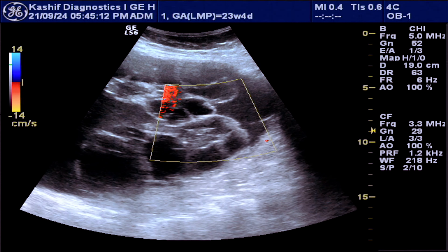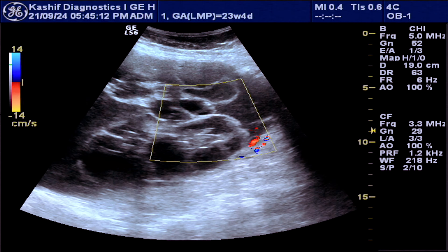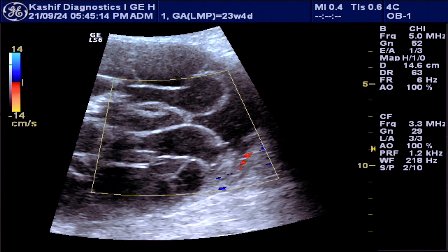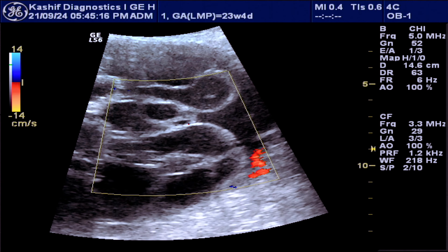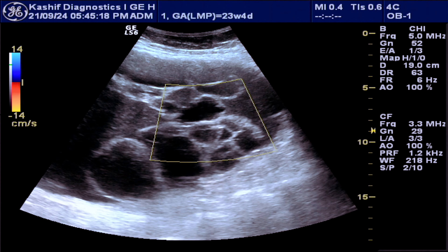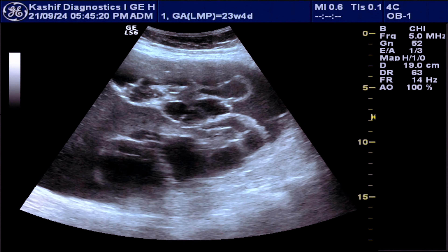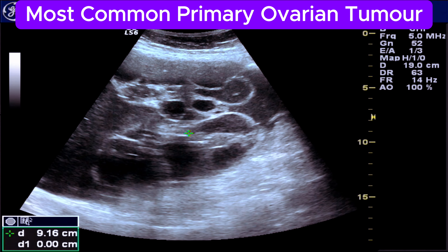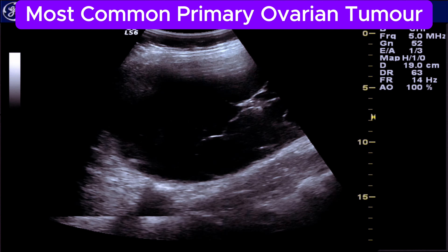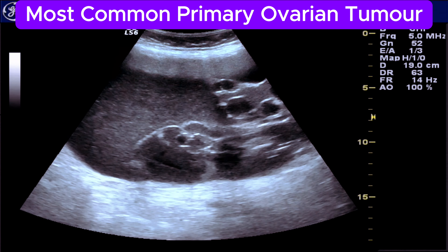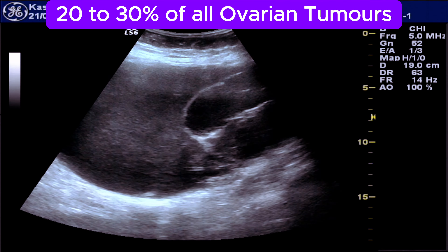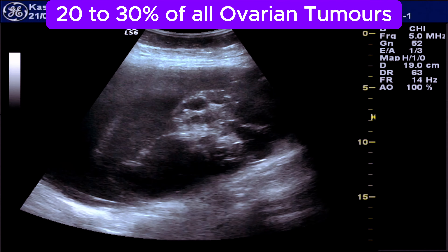All these findings give the diagnosis of ovarian cystadenoma. This is a benign tumor that develops in the ovary and is the most common primary ovarian tumor. The tumor accounts for about 20 to 30 percent of all ovarian tumors.